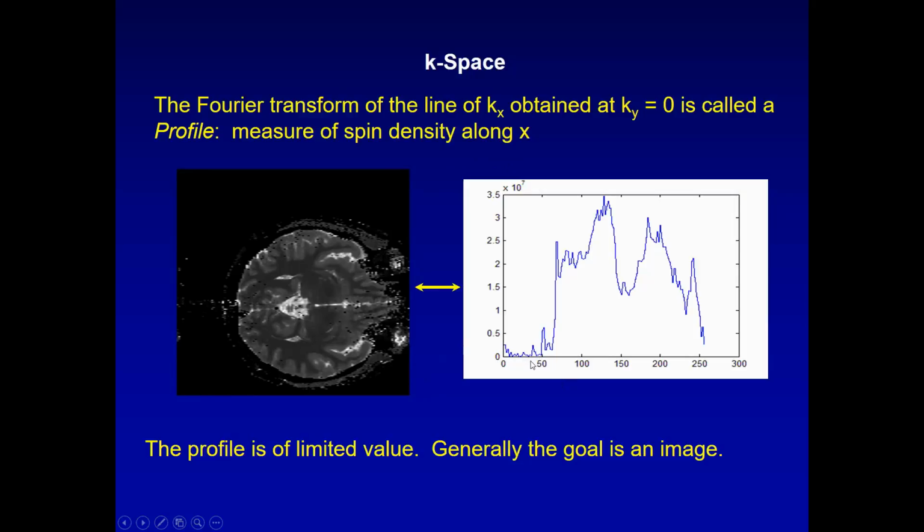It's looking at how much, if you could draw a column through here and add up the image intensity, the proton density along each of these columns, that's what you would see here on the right. Here's the column at location A. Well, there's a maximum there.